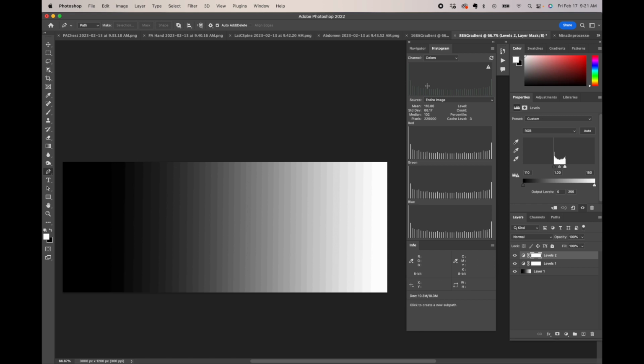So you may ask, okay, why would you ever work in 8-bit then? Well, an 8-bit image could be perfectly fine when it goes to press, because again, with 16-bit, 32-bit, all that, there are so many shades that our eye can't distinguish them, and we can't even tell, but it shows up when we do those adjustments.